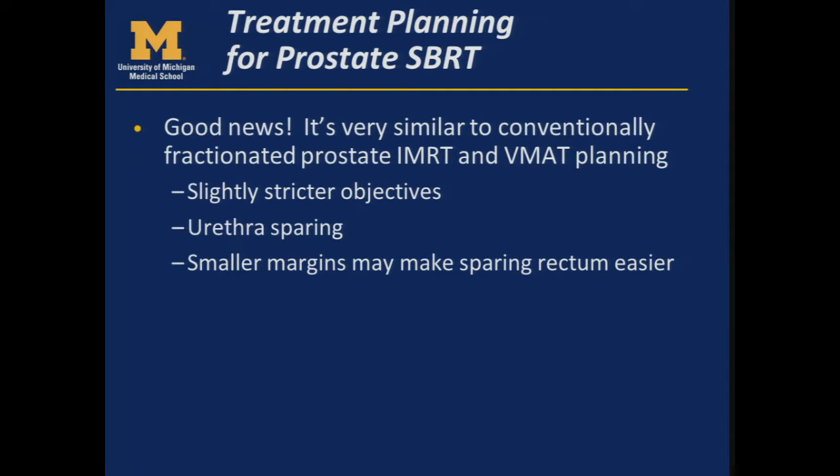Good news on treatment planning for prostate SBRT. It's actually very similar to treatment planning for conventionally fractionated prostate IMRT and VMAT planning. You're not necessarily trying to create that same SBRT-like dose distribution that you want to get in, say, a lung or liver SBRT.